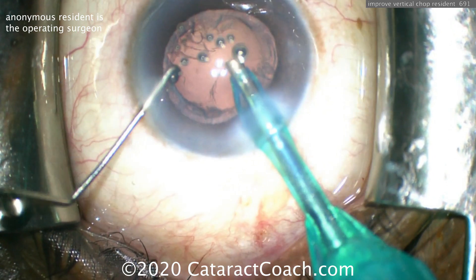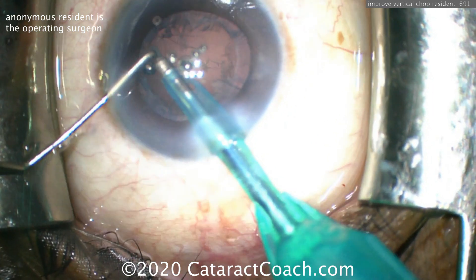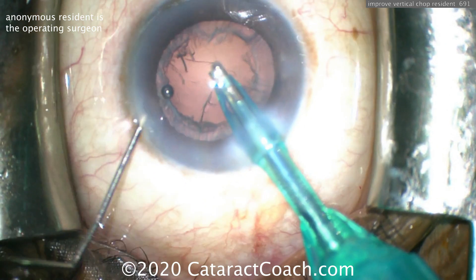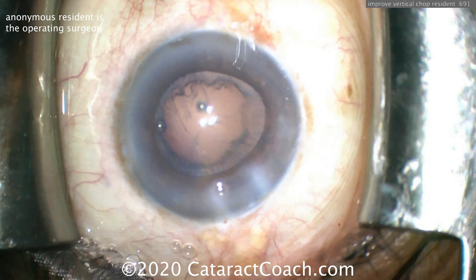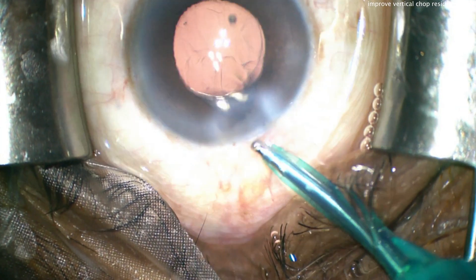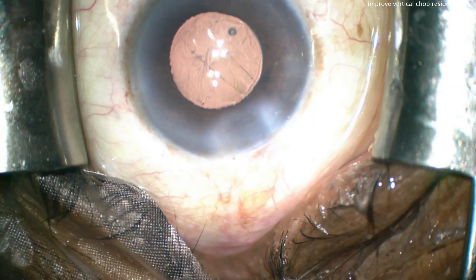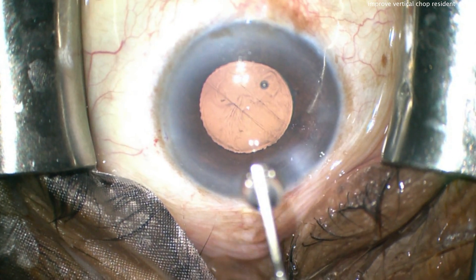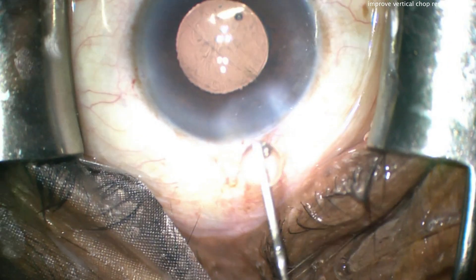Great technique — I'm very proud of you, coming along nicely with those skills. Take my advice on two things: one, adjust those settings to avoid the post-occlusion surge we saw throughout the case. And two, make sure when you chop you have complete occlusion of the phaco tip and the vacuum level is nice and high — that tells you that you really have a strong purchase and are holding the nucleus very firmly. Then the vertical chop will progress very nicely. Great technique, keep up the good work.